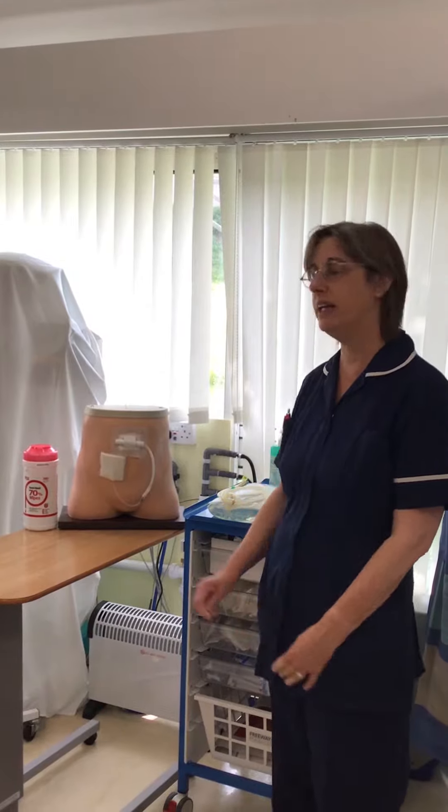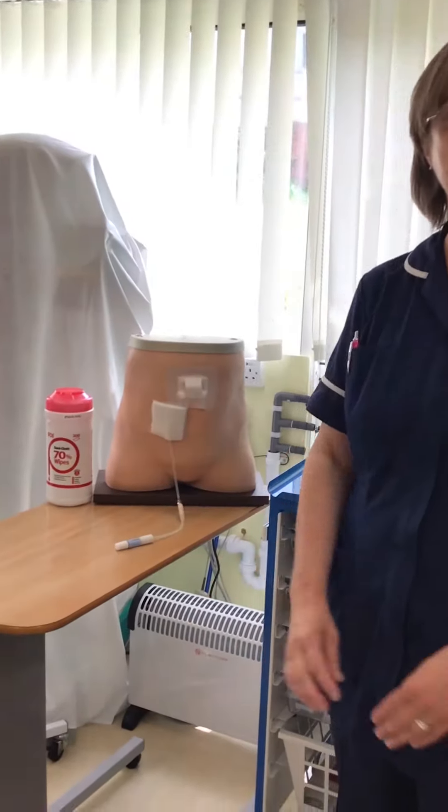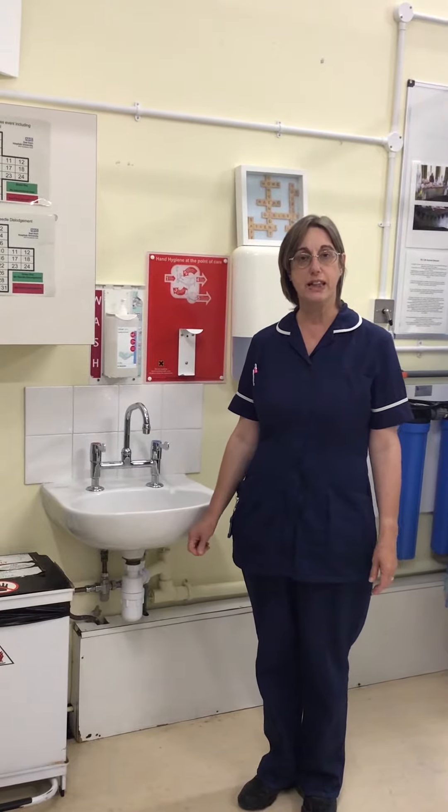Before you wash your hands, you need to free up your line, allowing for easy access once your hands are clean. Once you've gathered your supplies, you then need to wash your hands.